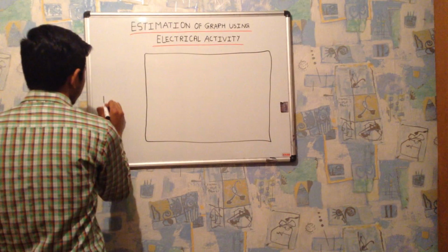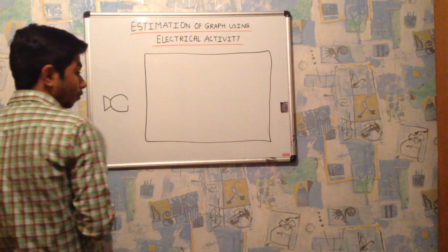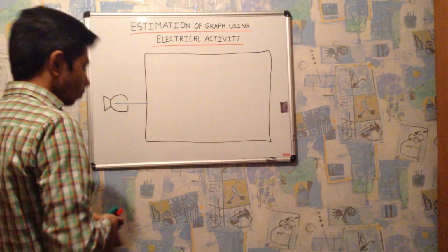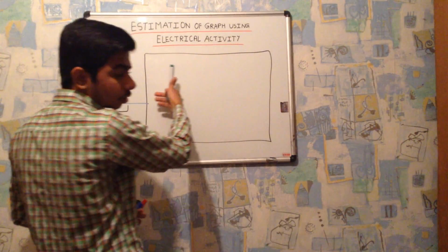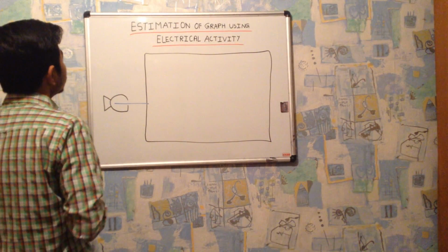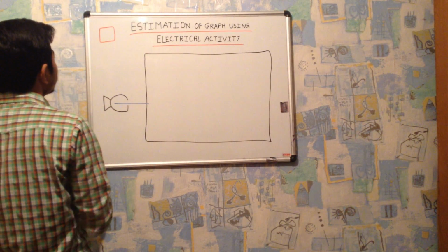And outside we have a galvanometer, whose needle is coming out from this galvanometer onto this paper. Actually, what happened, our graph paper will move in this direction at the speed of 300 big squares per minute. What I mean by big squares, actually, let's suppose here I am drawing one big square, and it has several small squares in it.